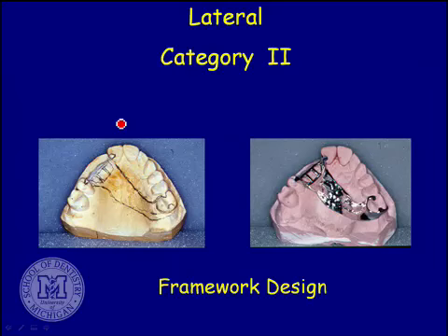Your first survey is with everything level with the world. What you're looking at there is the clasping you try to get on this tooth. When everything's level with the world, the hope is that you're seeing some undercut on the proximals of those two teeth. So when things are sitting level, you're looking for where's your undercut on this tooth, and do we have an undercut on the proximals of this?